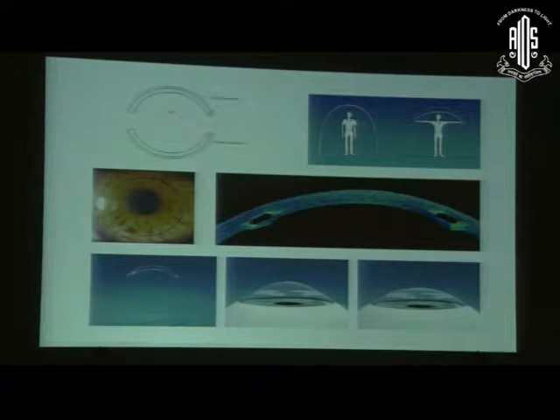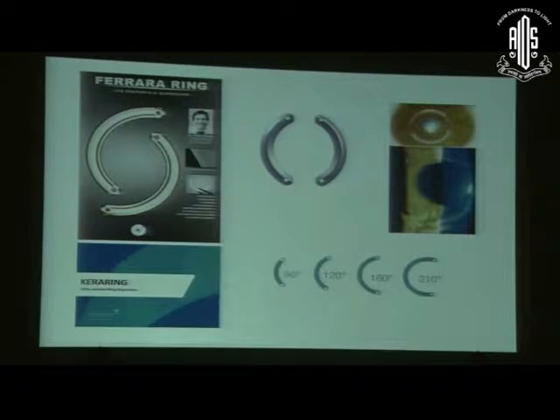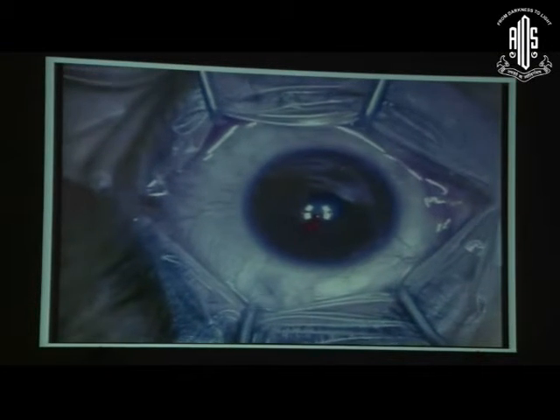to the cornea, and the corneal fibers are stretched, thereby allowing the ectatic part of the cornea or the corneal curvature to flatten. So you have the other rings, the Ferrara rings or the Kera rings, and in the surgical procedure, it's much simpler as compared to the manual technique of Intacs placement that we were doing, because that had a vacuum suction ring. And for me, the problem was the centration, because if your vacuum ring does not center very well, it's very difficult to get your manual dissectors to go into the same plane.